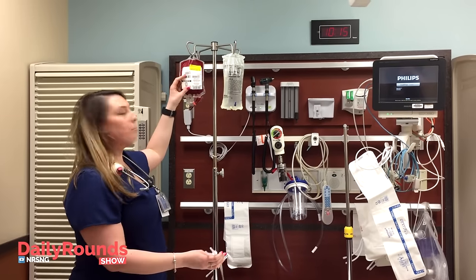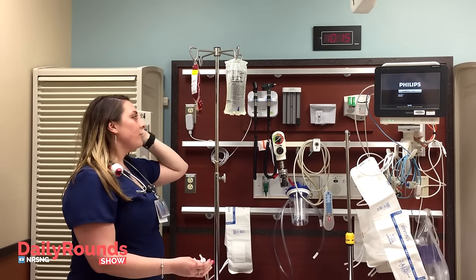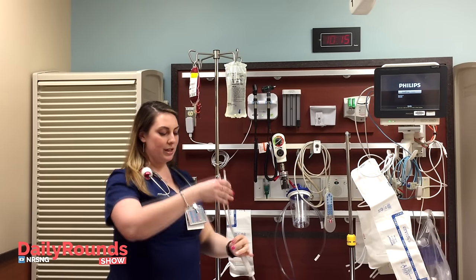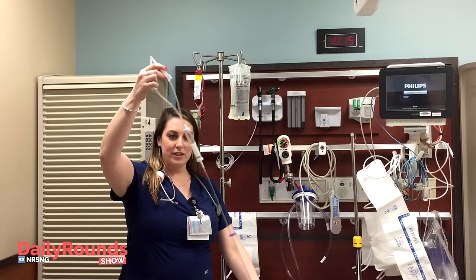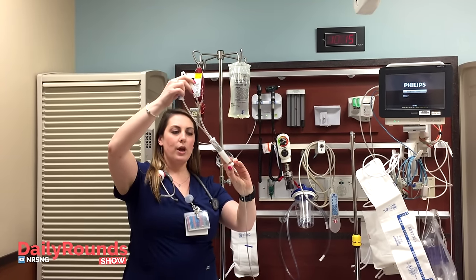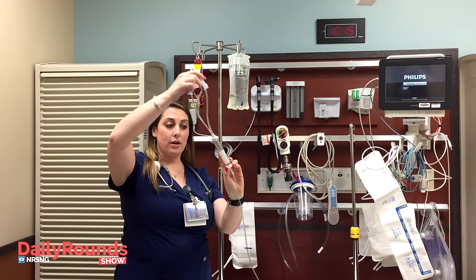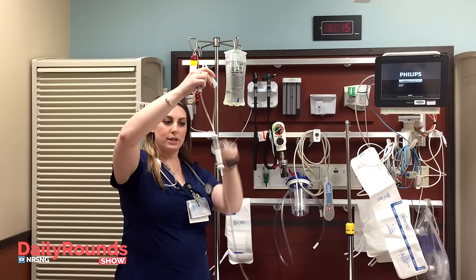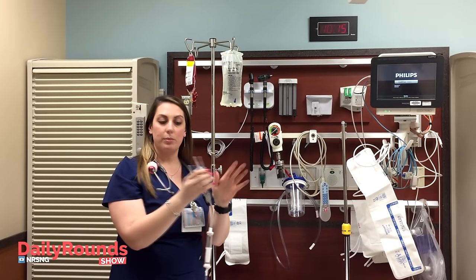I have some O-negative blood here. Whenever you hang blood, you want to make sure that you also have a bolus of normal saline to go along with it. This is what blood tubing looks like. This is a leukodepleted filter. You want to make sure that normal saline fills all the way up to the middle so that you don't have any of your red blood cells hitting the filter and potentially hemolyzing.